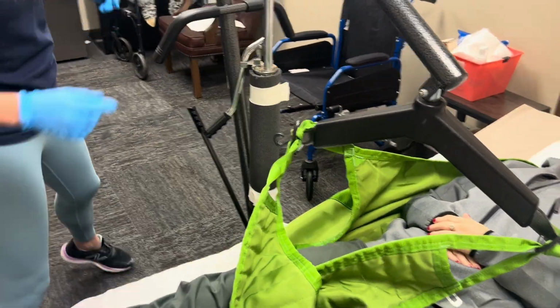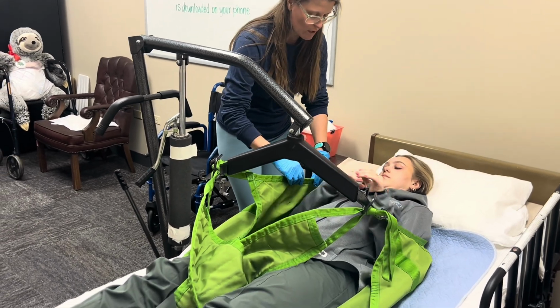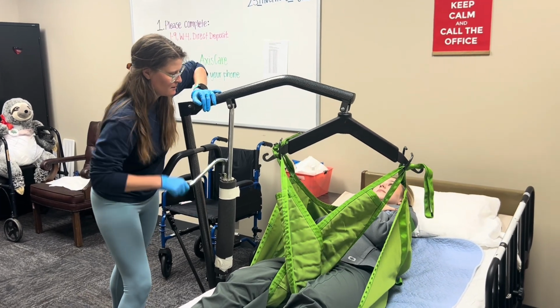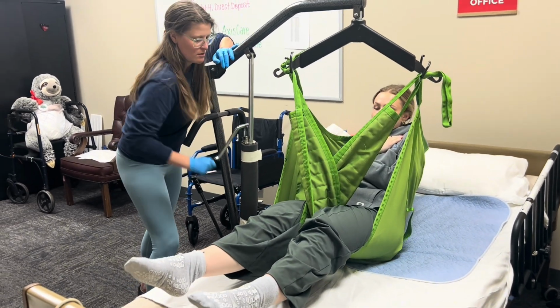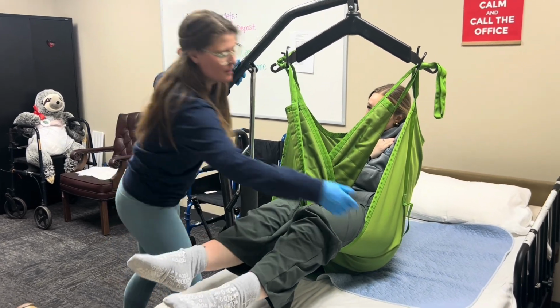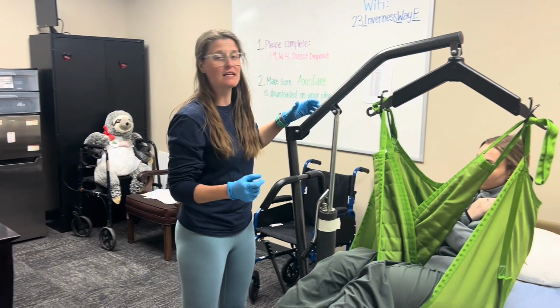Now we are in. What I'd like to have my clients do is either give themselves a little hug or hold on to the Hoyer, like you can hold on to the straps. Just relax. So now I'm manually pumping. And I want to make sure that my client is high enough that she is no longer on the bed, and that makes it easier to move. This is when it's nice to have a second person.